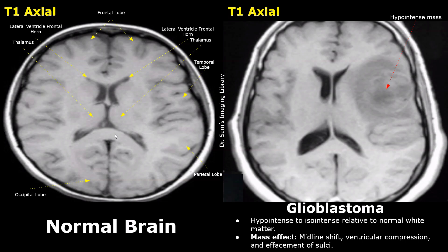For easier understanding, we will compare the glioblastoma images with images of the normal brain. These are images in the axial plane. In a T1 weighted image, tissues with high fat content appear bright while water-containing tissues appear dark. The lateral ventricles appear dark or hypo-intense because they contain cerebrospinal fluid. The inner white matter appears bright or hyper-intense because it has high myelin content, which is fat content, and the outer gray matter appears darker than the inner white matter. The gray matter has less fat content — it actually appears gray in T1 images. The bones appear black in T1 images with no MR signal.